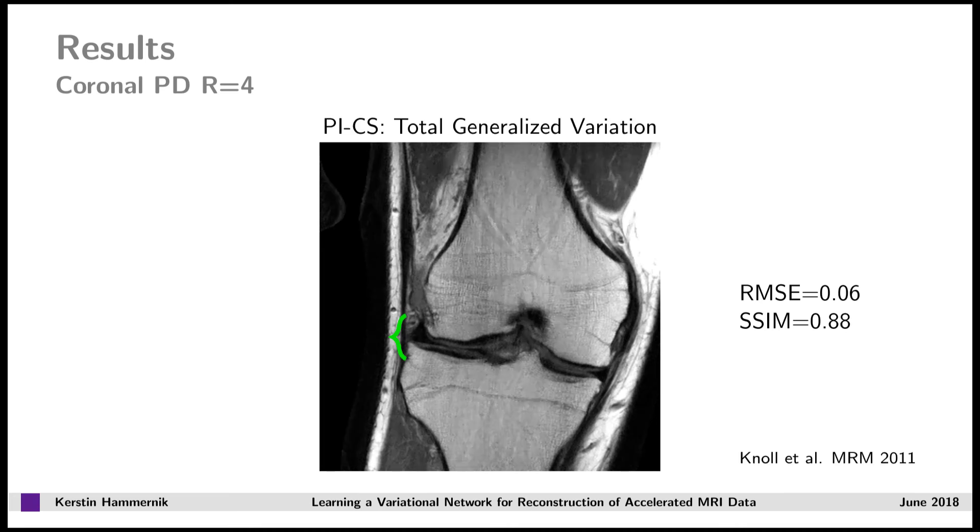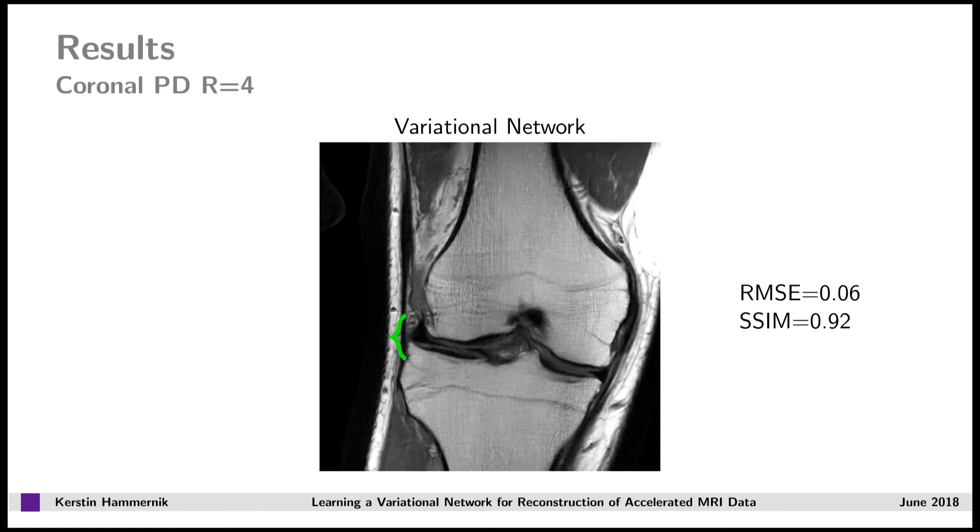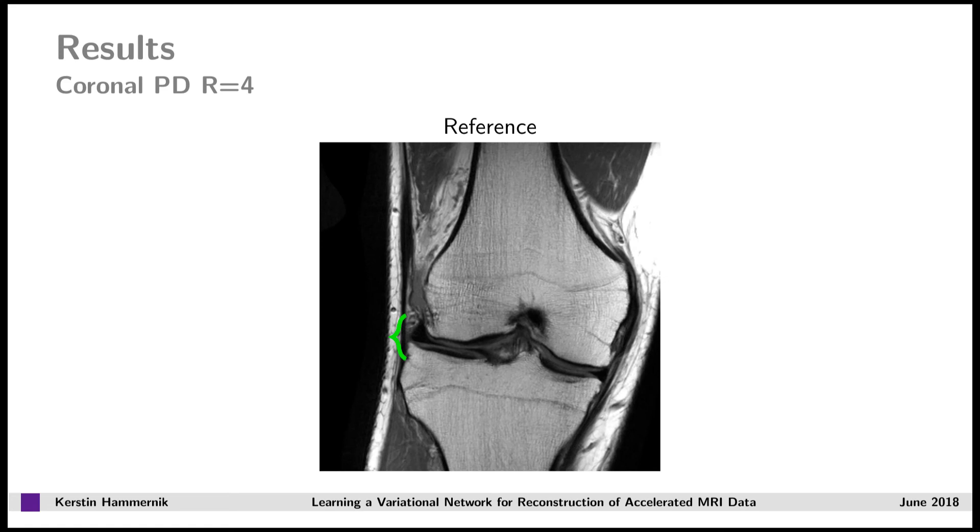If we use a total generalized variation approach, the artifacts are reduced. We also compare to dictionary learning, which shows very good results in this image. If we compare this result now to our variational network reconstruction, we observe both improved image quality in terms of sharpness and reduced undersampling artifacts, and improved quantitative values in terms of RMSE and structural similarity index. Here is also the comparison to the fully sampled reference.